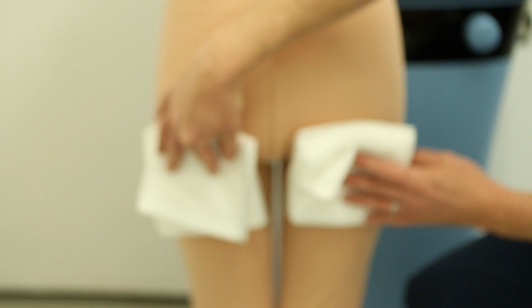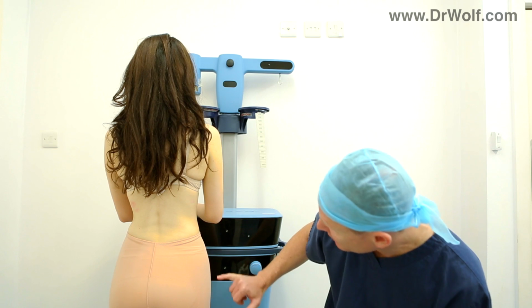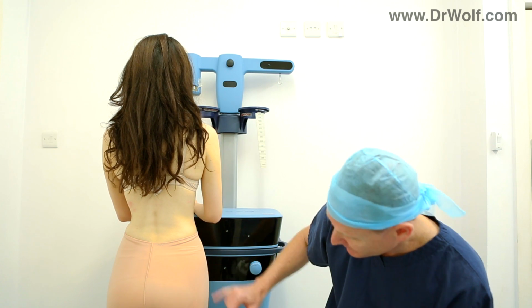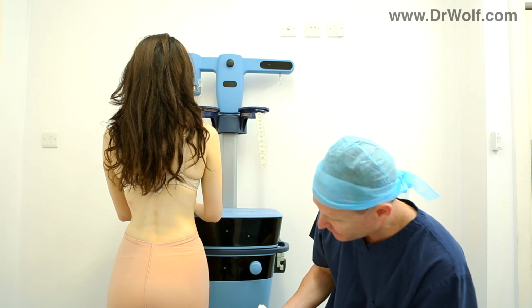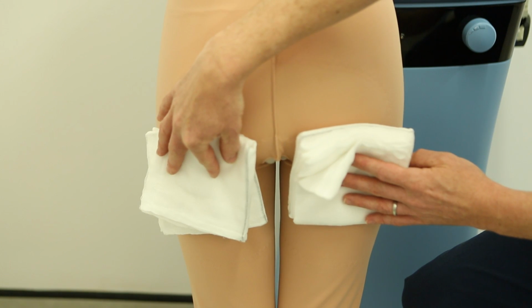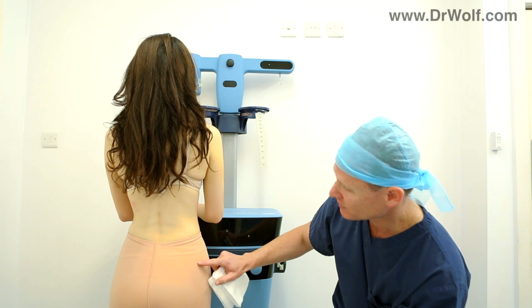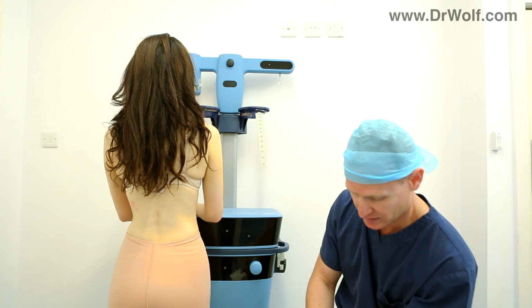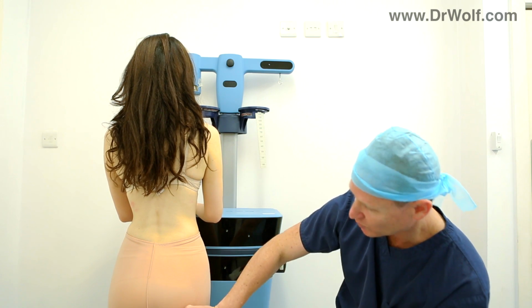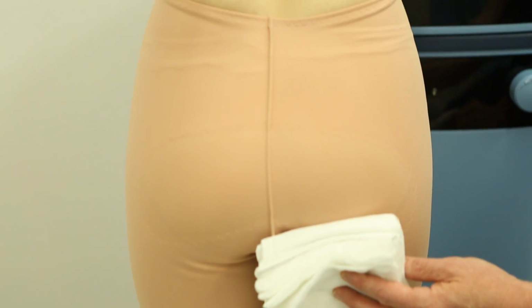So I'm going to show you the access points for when I treat the outer thighs. We generally do 1 on each side of the buttocks crease, which is nicely hidden, 1 on the outer thigh in the underwear line. And in those places, again, the padding for the first 24 hours will be quite significant to absorb any of the leakage. The majority of the leakage will come from this access point. You hardly tend to get any leakage from that. And then after the first day, a small amount of padding like that is going to be sufficient to absorb any of the trickling that will take place.